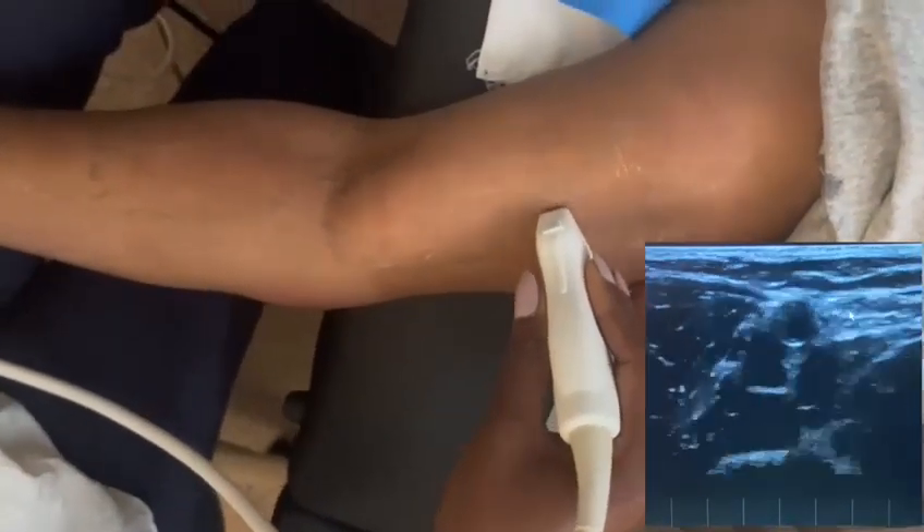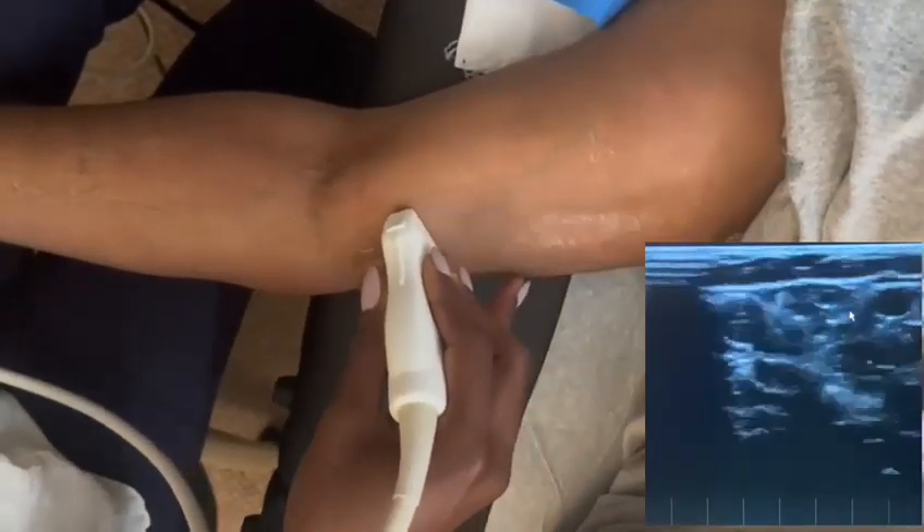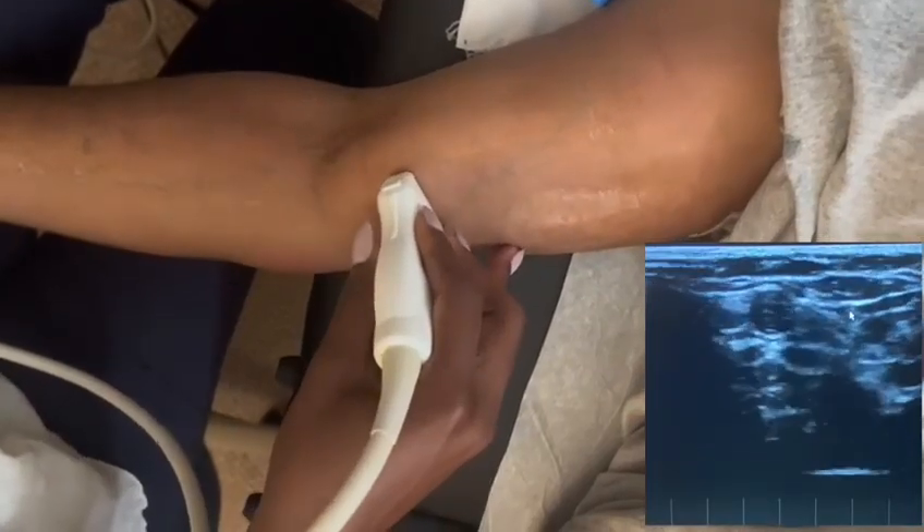Going back up the arm to look at the brachial veins — you can see the brachial veins and the artery. When you're doing a DVT study, you are compressing, just compressing, making sure that vein compresses. As you get into the fossa, you get a lot of different vessels.